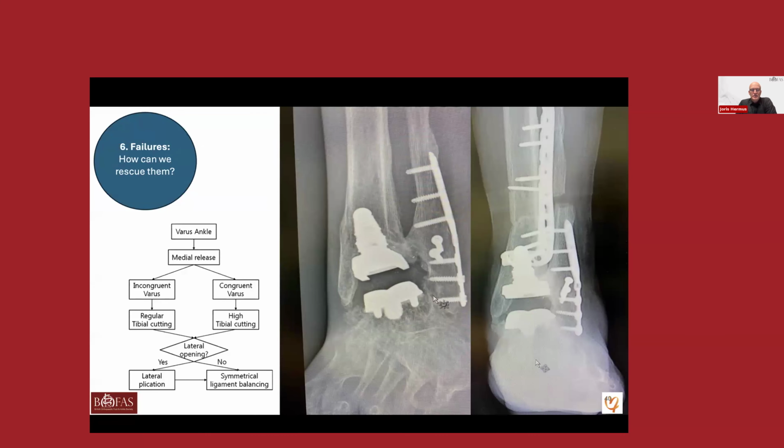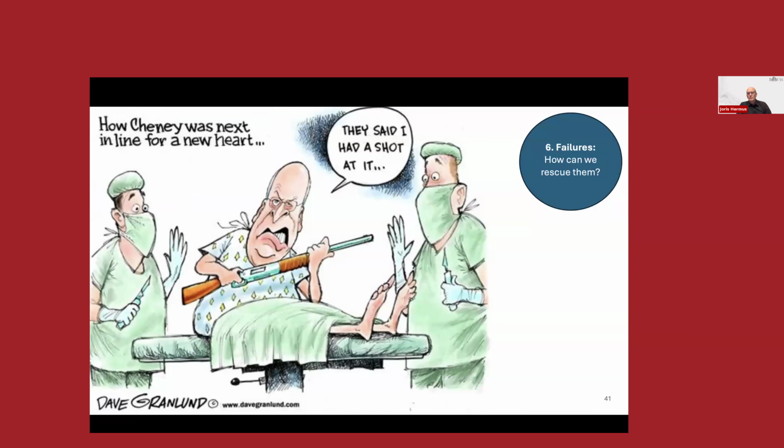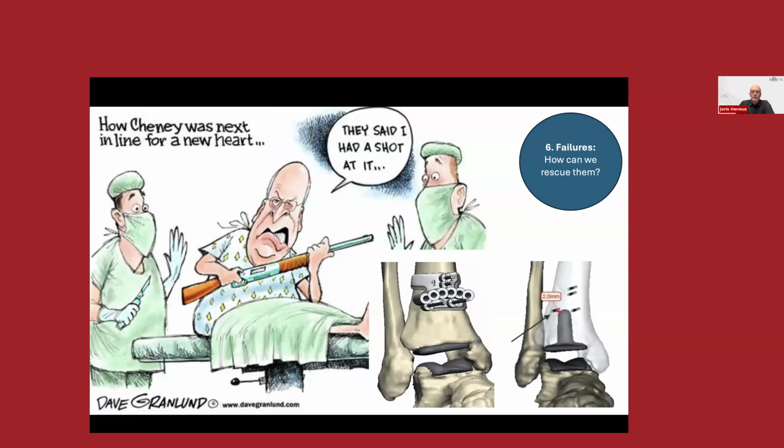That's in the case of a valgus and a varus malalignment, but we need to be aware that when we do this kind of surgery, we most of the time have one shot to do it. And if we are not able to do it in this regard, these kind of PSIs can be very helpful. But if it's not very common in your center, please refer them to the right center.